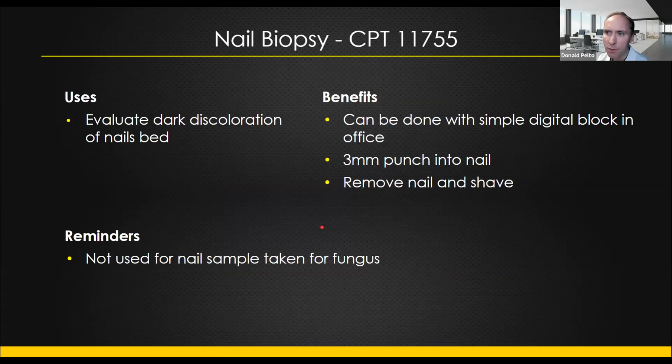Nail biopsy, this is something that I do, like maybe I do punch biopsy first, then I do curette, and then maybe nail biopsy. So I use it to evaluate dark discoloration of the nail beds. Once again, a reminder, this is not a nail sample. A nail sample is not considered a biopsy. Taking a nail sample to evaluate for fungus is not a biopsy.